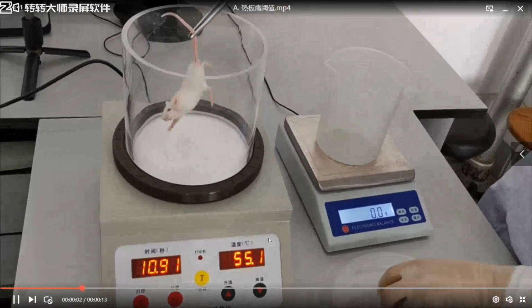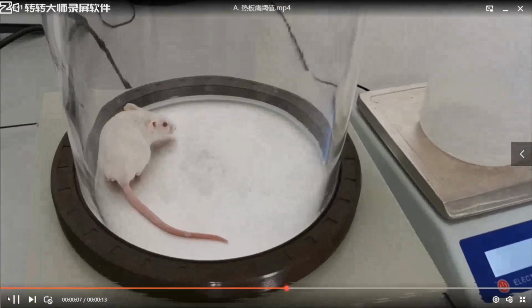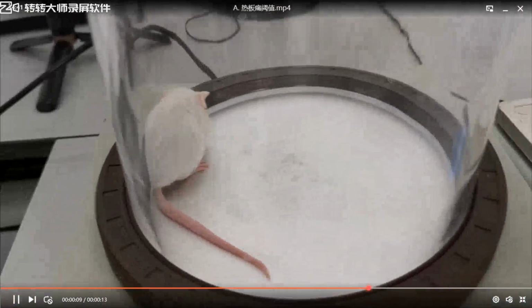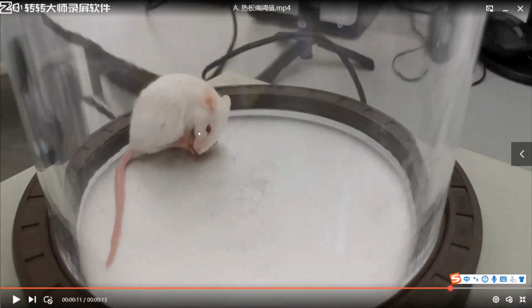And the second mouse, test the pain threshold. Have you seen? The mouse licks because of pain, because it is too hot. So the mouse licks its hind claw. And this period, this time, we call the pain threshold.